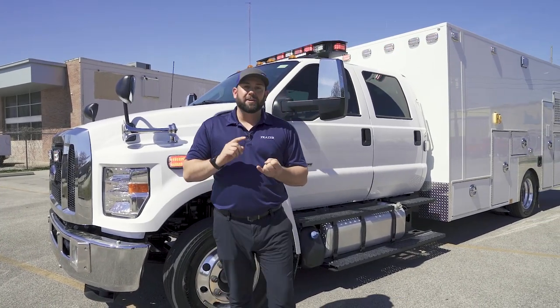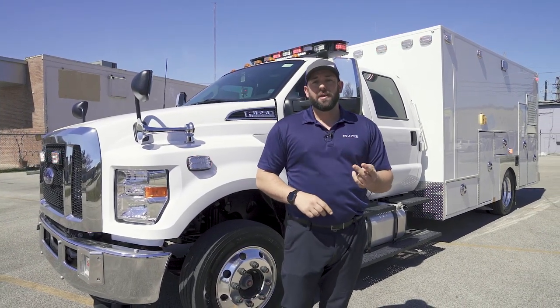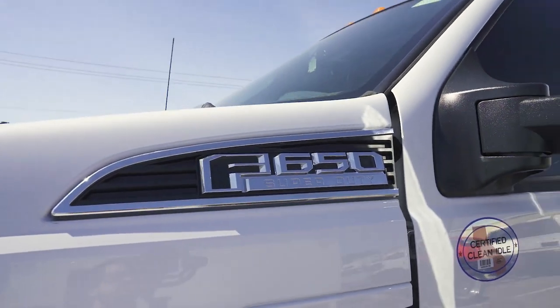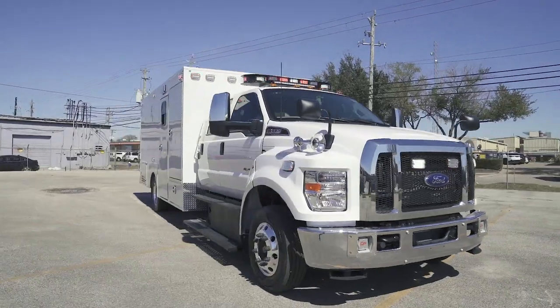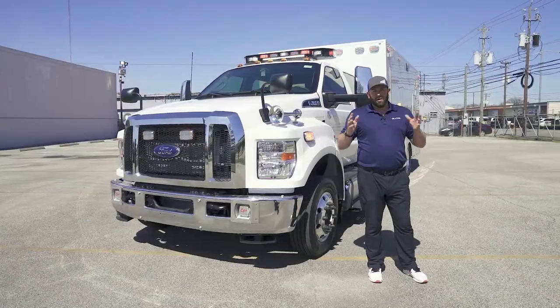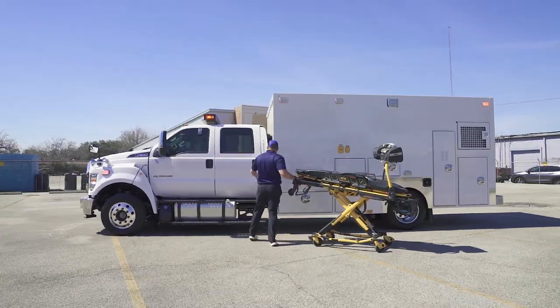A little bit about the truck: it's a Type 1 15-foot custom neonate transport unit with a dual load stretcher system, mounted on a 2022 Ford F650 crew cab. Because it's a special critical care transport unit, they have a large crew — a medic and several nurses — so they need a bigger cab than a normal single cab.